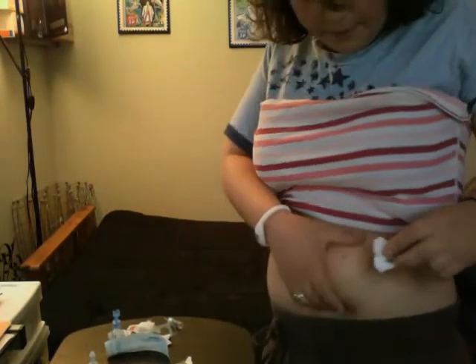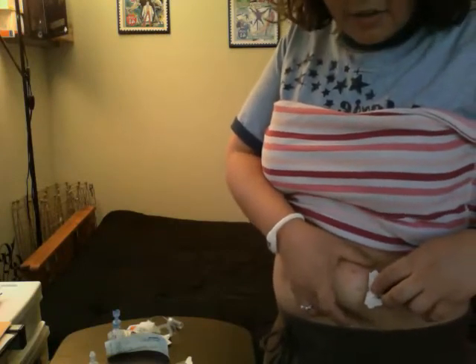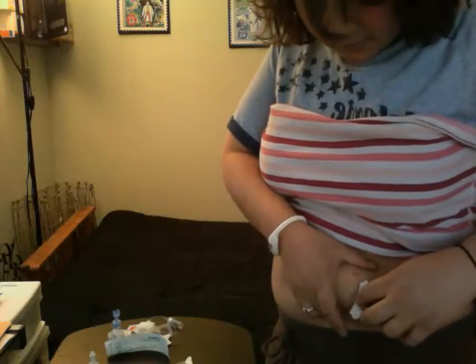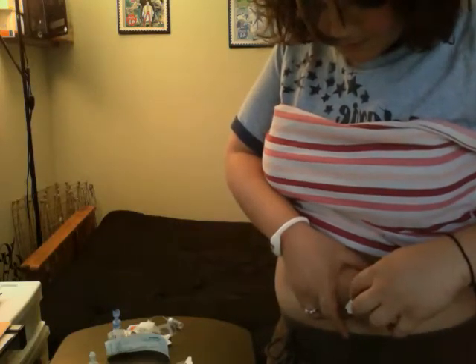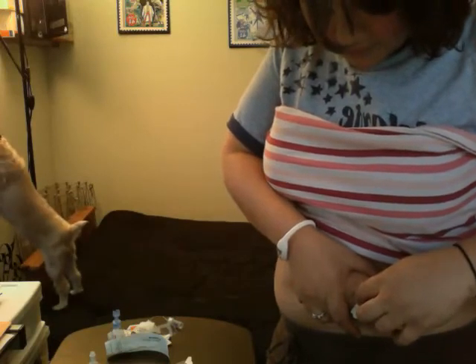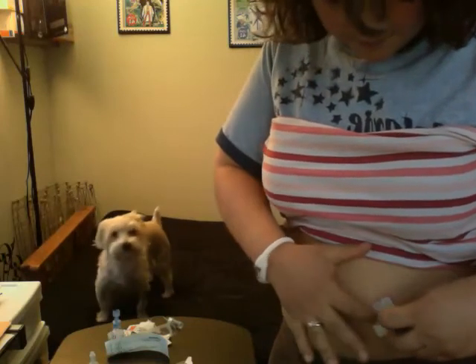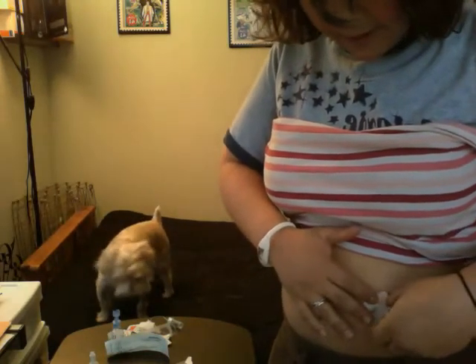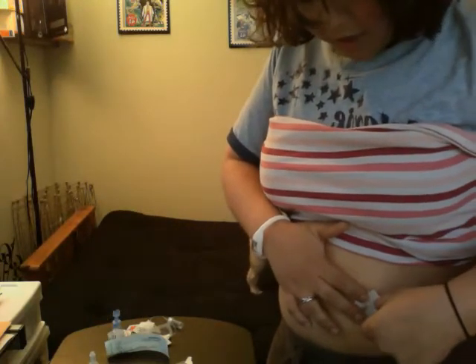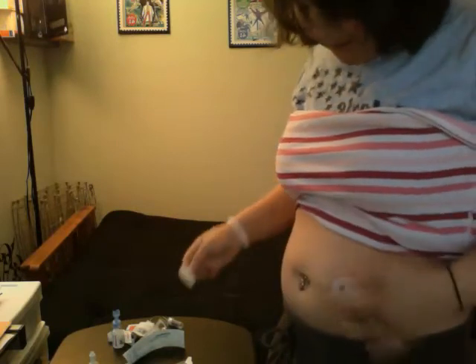Okay. So you pinch the fatty area. You hold it at a 90-degree angle. Some areas hurt. So. Push those all the way in. Put that sticky tape down. You pinch the dark gray needle. You pull the needle out. Put that in my dispose pile. I rip off the other paper, so now it's all sticky. Push it all down.